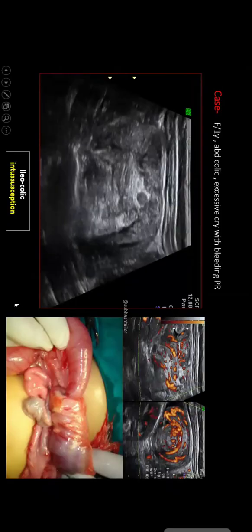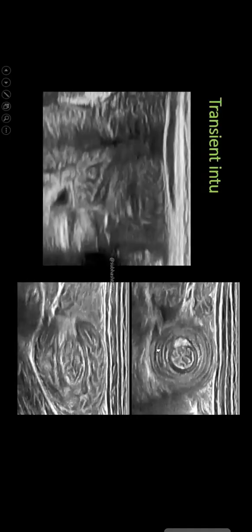This is the operative photograph of the same patient. Transient lead points we can see, but we must re-evaluate the patient. These are all normal sometimes. But we have to mention that the patient is showing transient intussusception formation because there can be underlying malabsorption or some small bowel pathologies. But this is not pathological. This is simultaneously reducing and forming, waxing and waning, no edema, short segment, ileoileal.